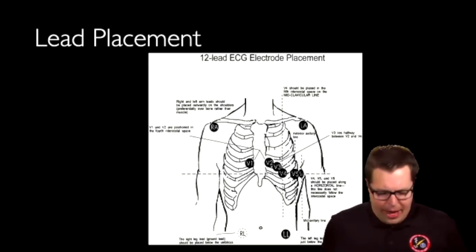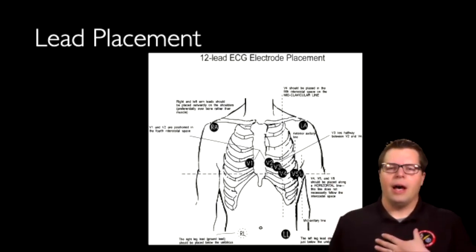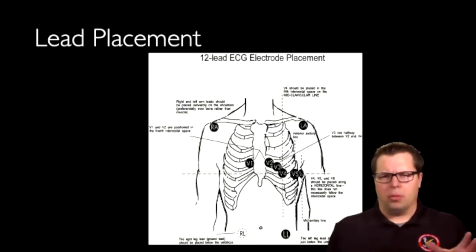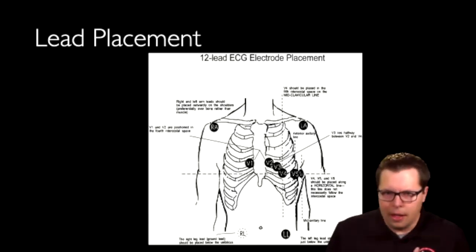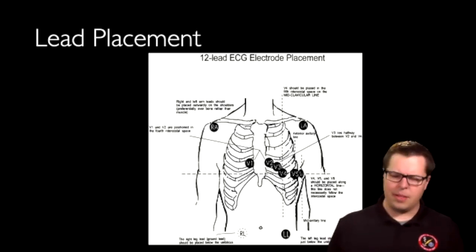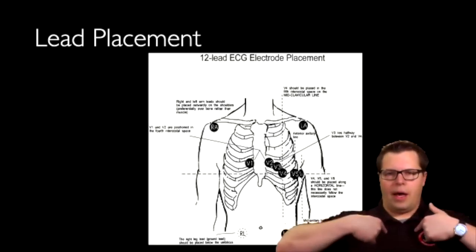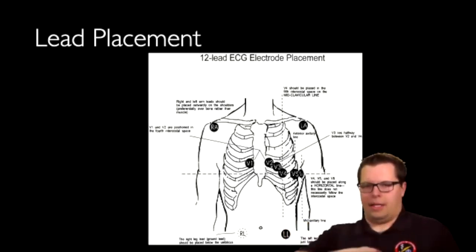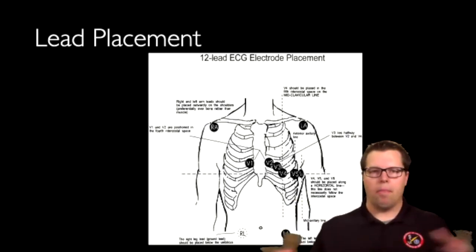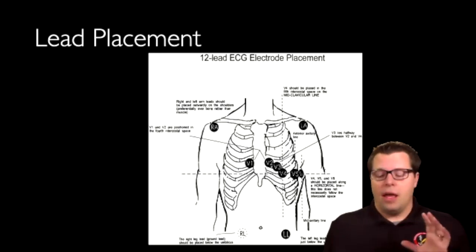I've actually had a patient, I think it was a fellow at the time. They got his initial EKG, clearly no ST elevation or anything like that. But the guy looked like absolute butt. He was sweaty, he was pale, like something doesn't look right. We went in, we looked at where they had left the stickers on him, and V1 and V2 were up here, and V4 was kind of like, you can't see me, but like here. And we're like, all right, wait a minute, let's redo this. Put the stickers on right, boom, big anterolateral STEMI, which we wouldn't have seen if we hadn't placed the leads right.